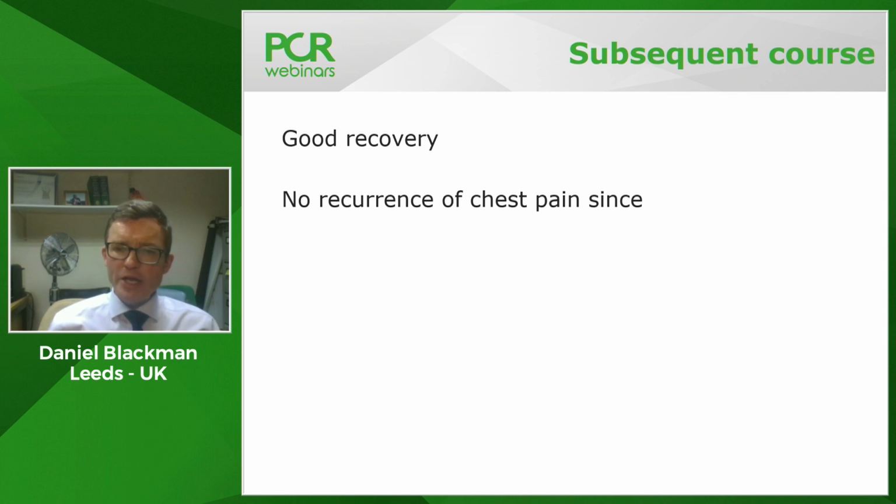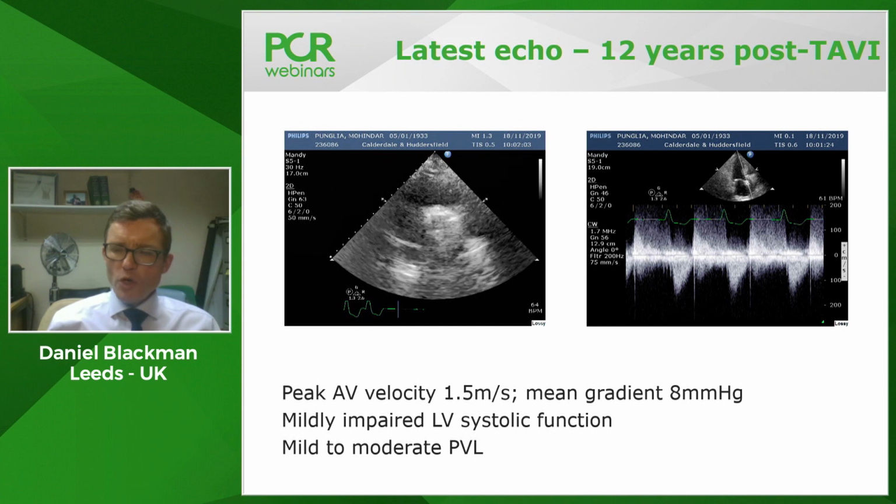And indeed it did. He made a good recovery. He's had no recurrence of chest pain since then. This procedure was 3 years ago. It's worth showing his echocardiogram. This is 12 years after his TAVI procedure.